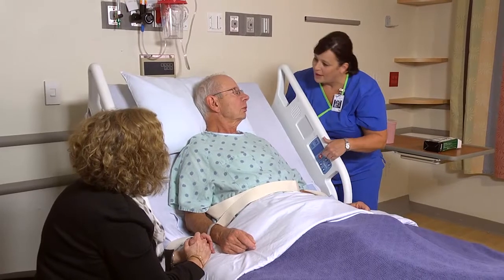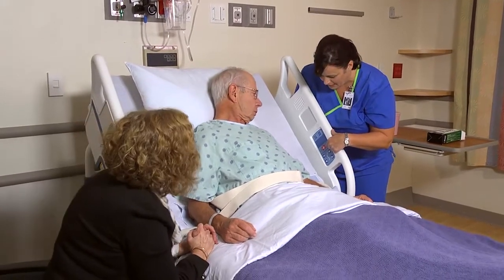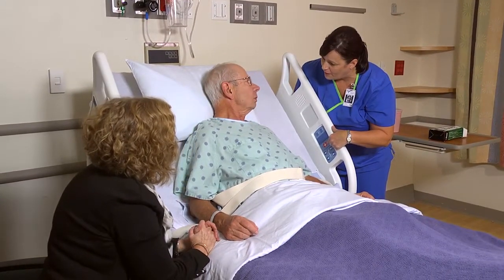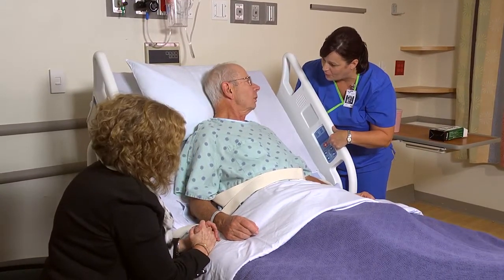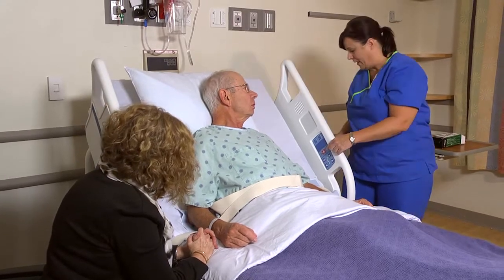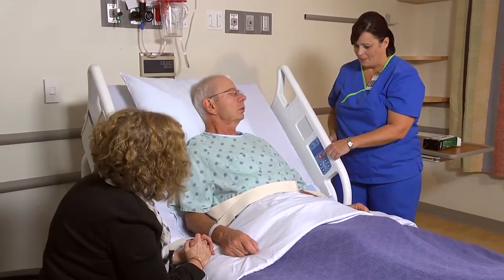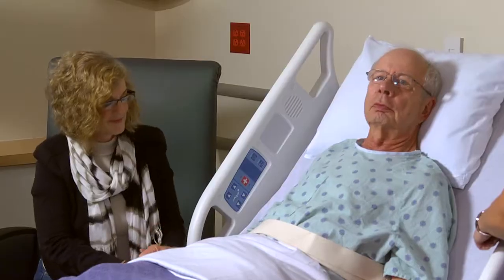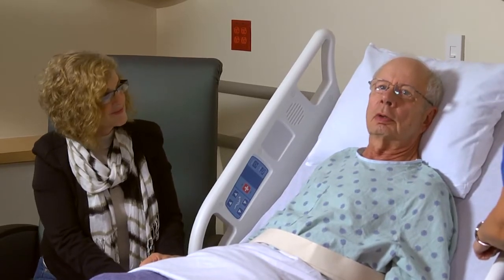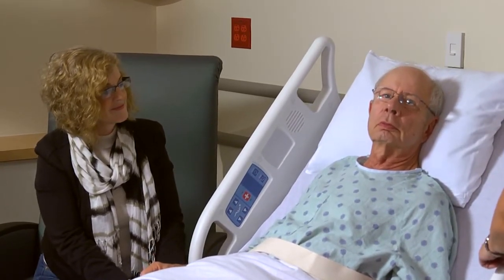Remove the restraints at least every two hours, or according to your agency's policy, and assess the patient each time. If he is combative or non-compliant, remove one restraint at a time, or ask another staff member to help you remove them.